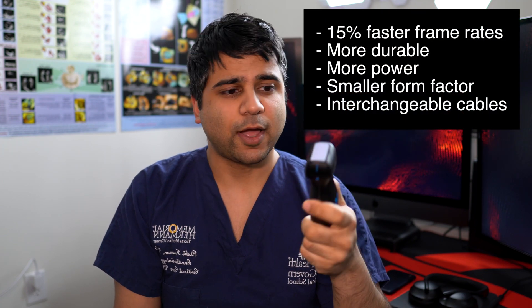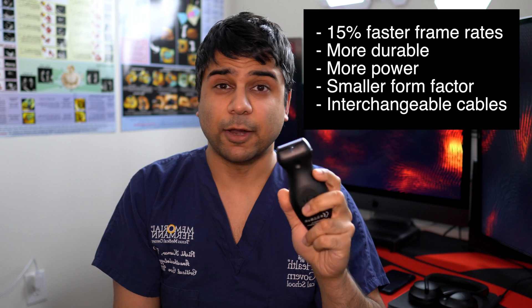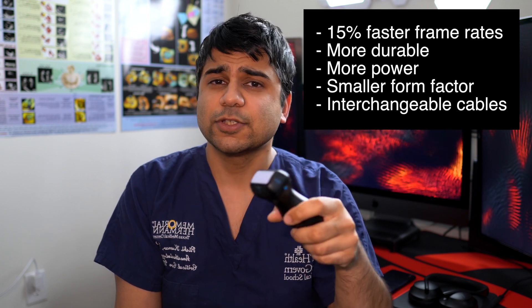Besides all the new specs — faster processor, better charging, better imaging quality, and provisions for future technologies — I love this device. I'm super excited to share this unboxing video with you all of the Butterfly IQ Plus.